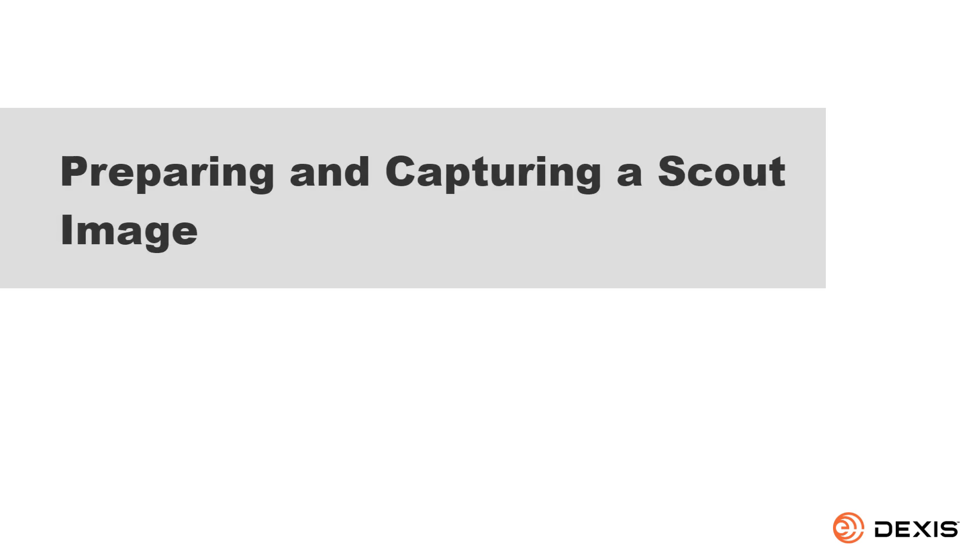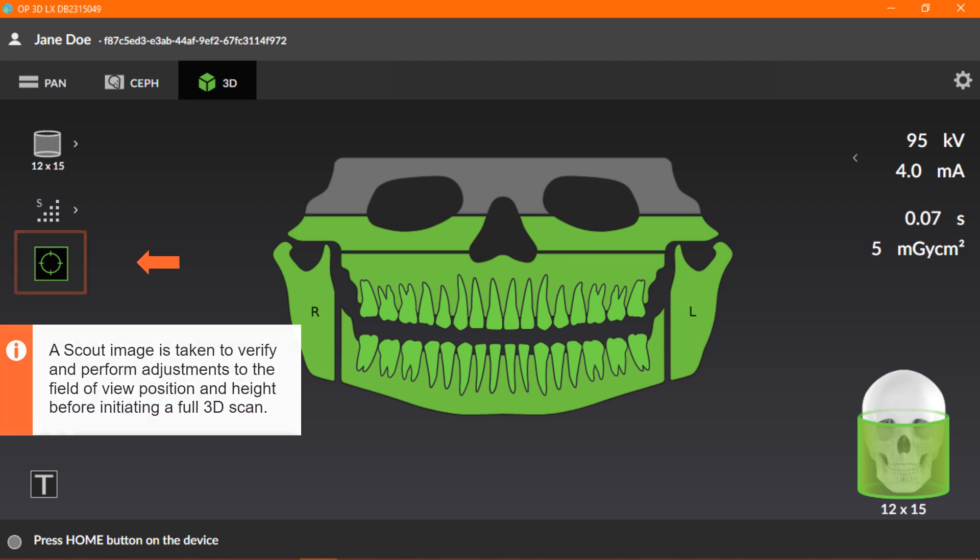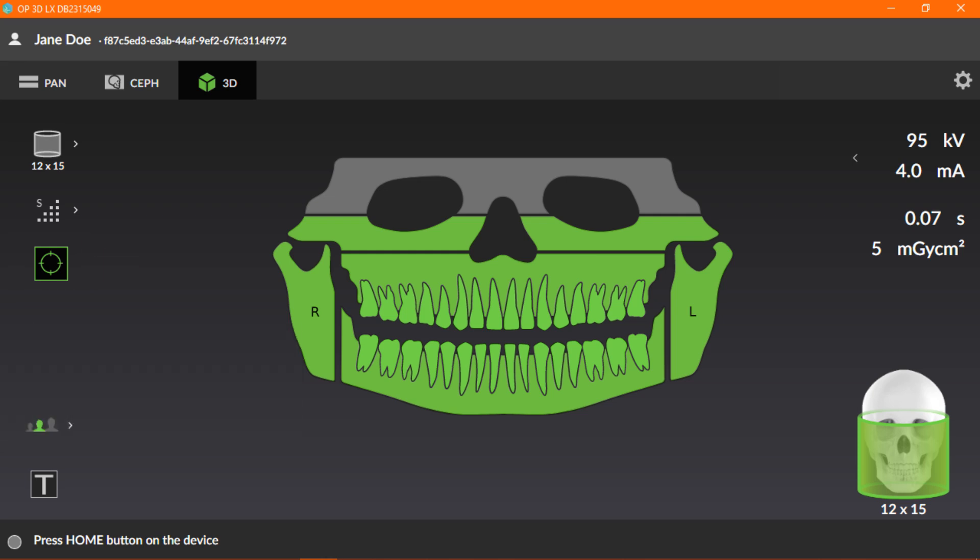Preparing and Capturing a Scout Image. A scout image is taken to verify and perform adjustments to the field of view position and height before initiating a full 3D scan. By default, the scout image is always active when taking 3D images. Clicking the scout image icon will deactivate and activate it.